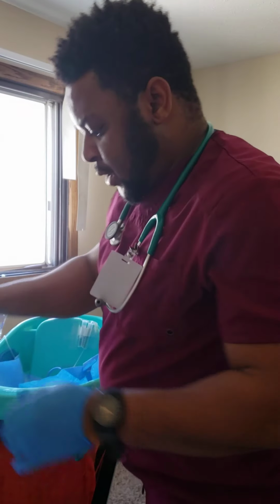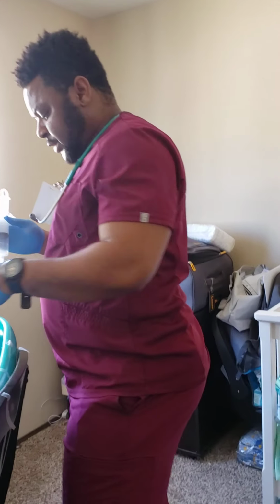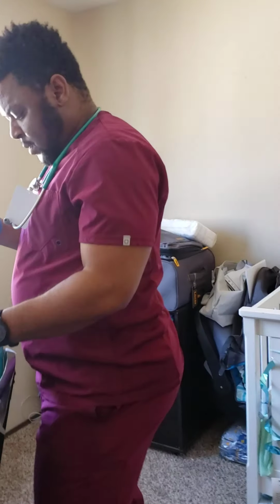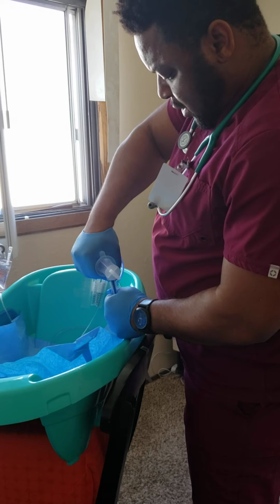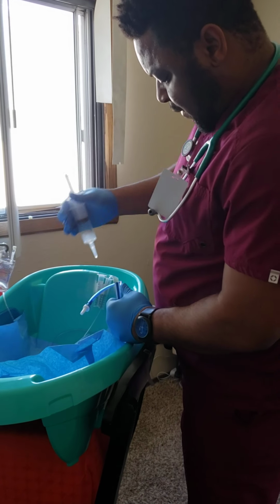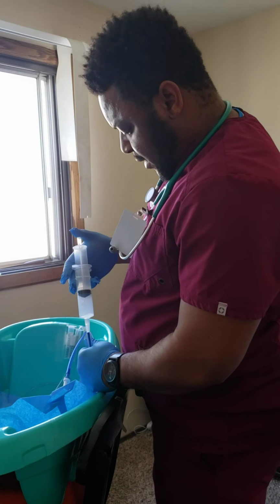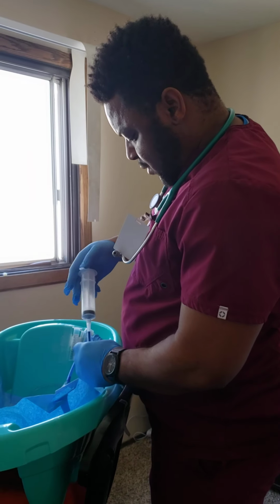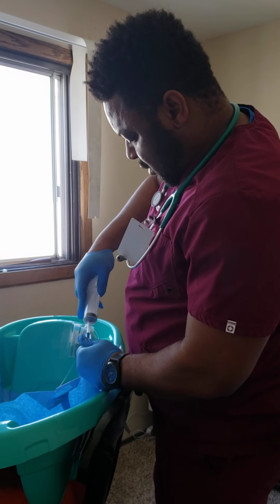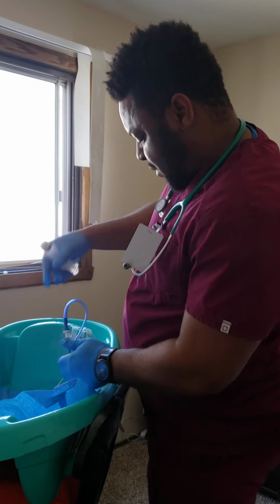Then I'll take my syringe to my patient and I will clamp the bottom of the tube. I'll take this off, put in my 20 milliliters of water and air, push it in, clamp it at the bottom back, take it off, clamp the top.